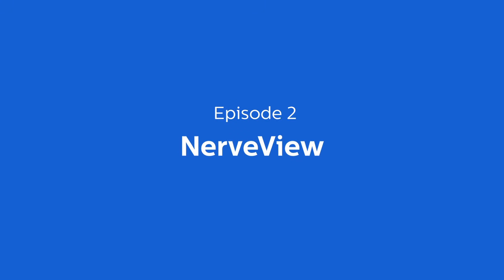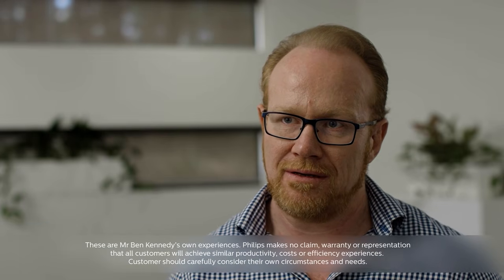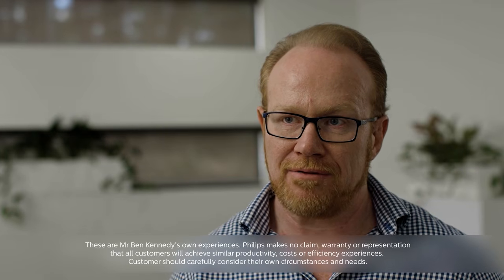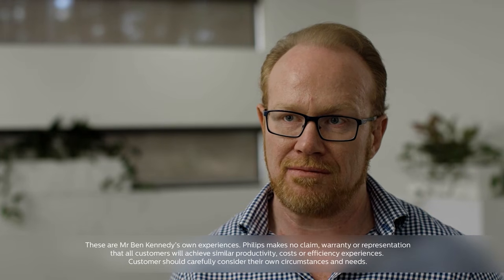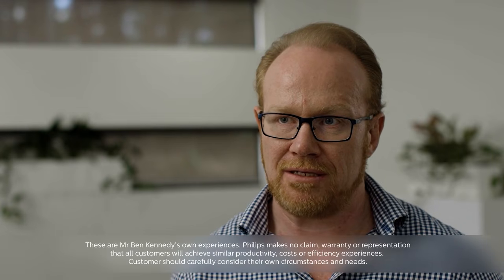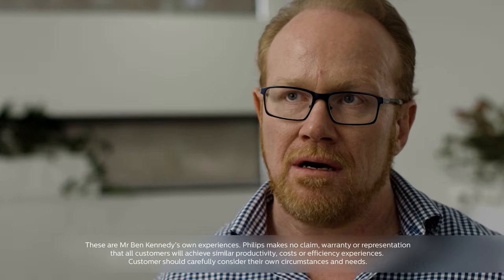The clinical question that we're answering today is often deemed very difficult, especially by radiologists who are trying to look at the images, is brachial plexus imaging. Often these patients present with pain, and often they're disappointing because you can get images that don't really show many reasons for that pain, and there's a lot of challenges that come with that area that cause that.